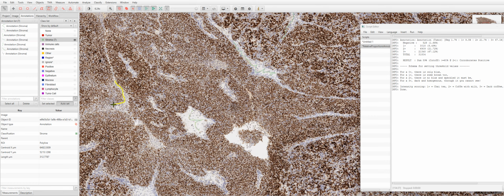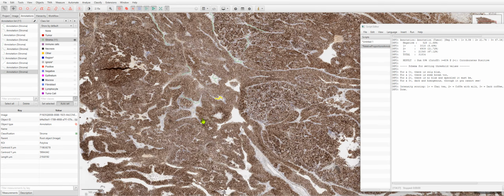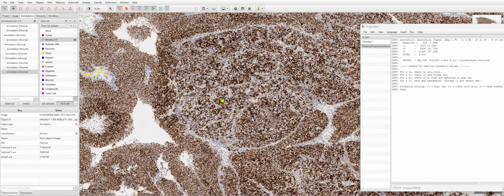So after I get maybe about 10 areas that show stroma, I'll do the same thing, placing these bars over the tumor cell fields. Let's get one or two more. This looks like it's a little busy in here. So I'll pick the polyline tool, follow some of these stromal lines, each time hitting the V key to use the same polyline tool again. All right, I'm satisfied with that. These are all labeled stroma.